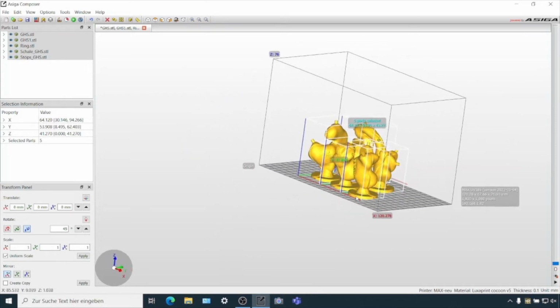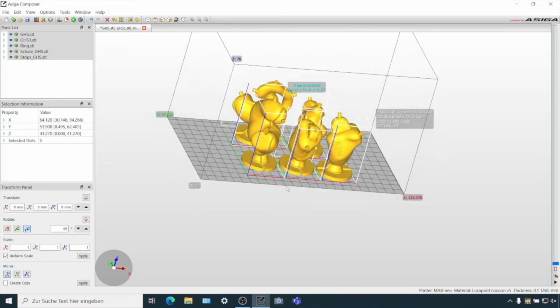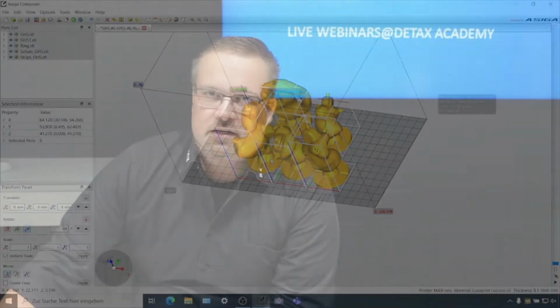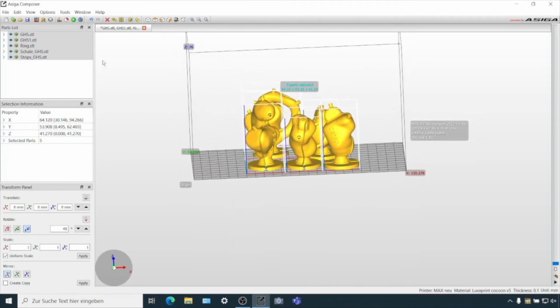And you can see here on the bottom, it is directly connected to the platform. You see here, this is a special base plate. It's designed from us to make it easier later for the opening of the cast form. There's no support style needed, no other parts needed. You can press here the play or the build button, create your print job and send it to the printer.